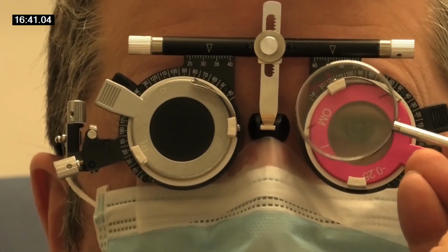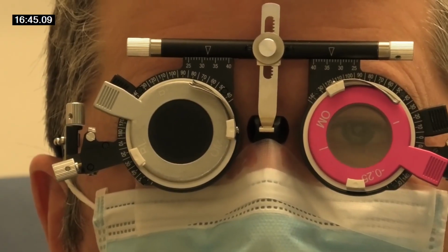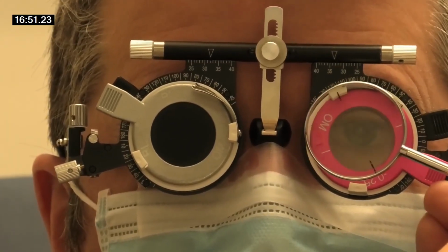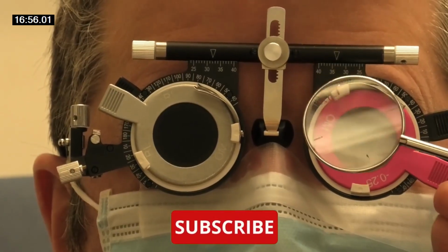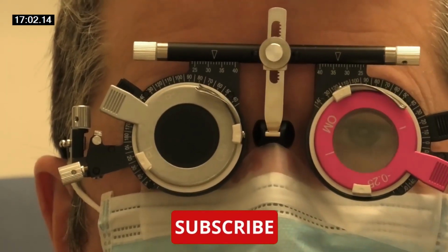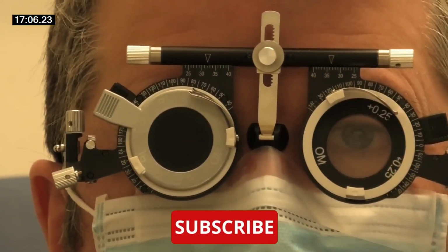Oh yeah. So I always think it's quite good to call it just when they see it, rather than this sort of better first, better second, better first, better second. So if you choose now, sir, better first, better second. Second, yeah. Okay. So that's how you choose it, which is what we thought.